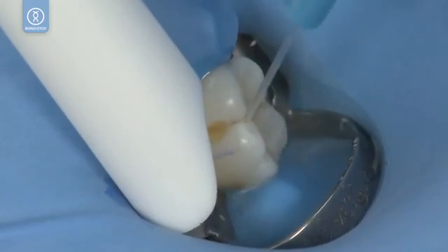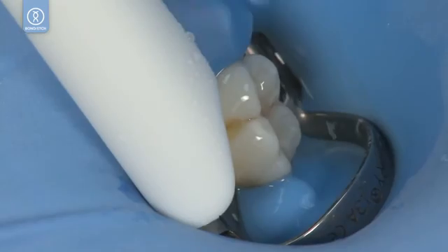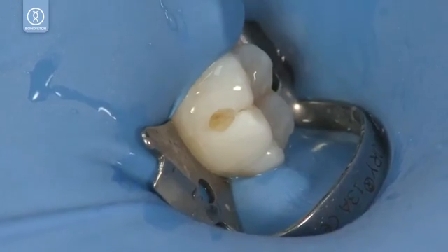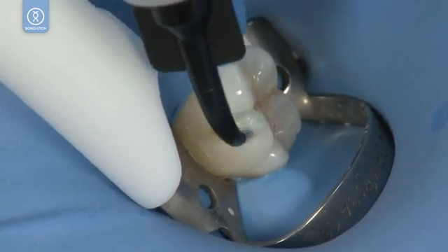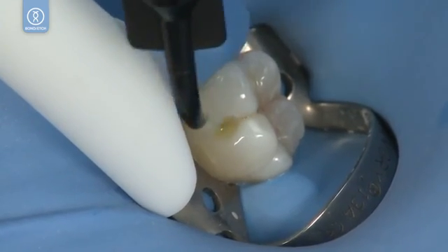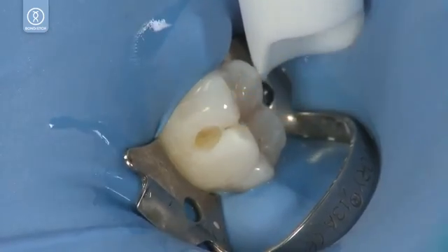Rinse and air dry, leaving the surface damp. Optionally, disinfect with Consepsis, then air dry — do not rinse.